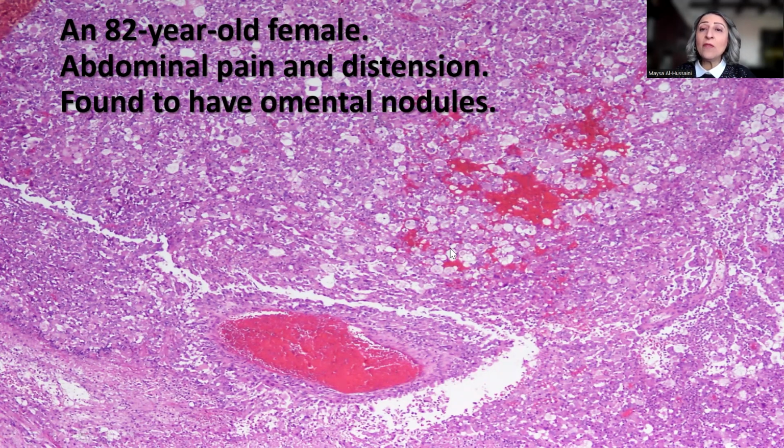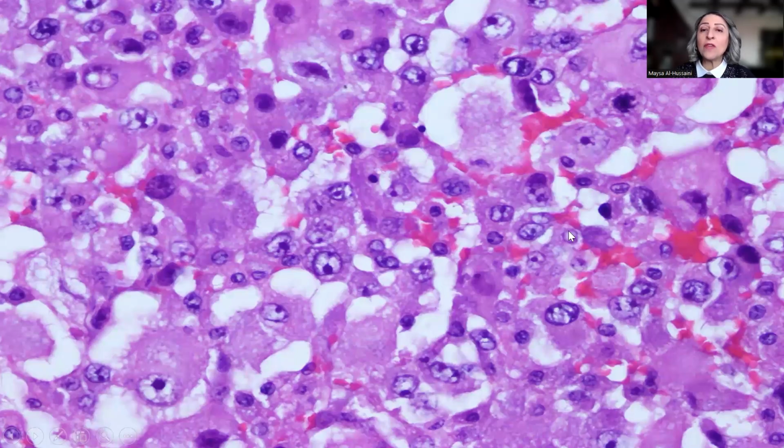On low power magnification, the tumor is pink in color, as you can see. And really, carcinoma stays an important topic in the differential diagnosis. Now, zooming into high power magnification, the tumor cells have abundant, large, voluminous acidophilic cytoplasm, vesicular nucleus, very prominent nucleolus. And still at this stage, probably mesothelioma would not be the diagnosis that would come to mind. But remember, an excellent clue to the possibility of the diagnosis is the voluminous acidophilic cytoplasm.